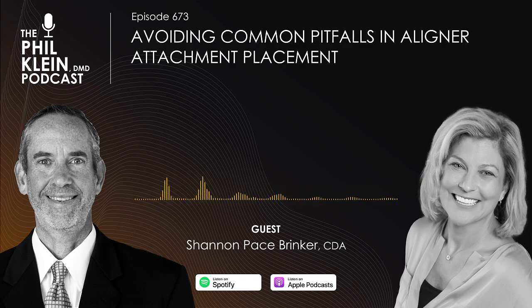Okay, so let's assume the template and the aligner fit very well. Nothing to worry about there. What's the next step? Yeah, some people like to use pumice. Some people like to just make sure, and some doctors do some air abrasion. Personally, I just haven't had to do that. I really feel like utilizing a good etch and then making sure everything's nice and clean works. But a lot of my team members and friends like to use just a fluoride-free pumice, and that's fine too. They can do that just to make sure everything's nice and cleaned off before we start acid etching the teeth.